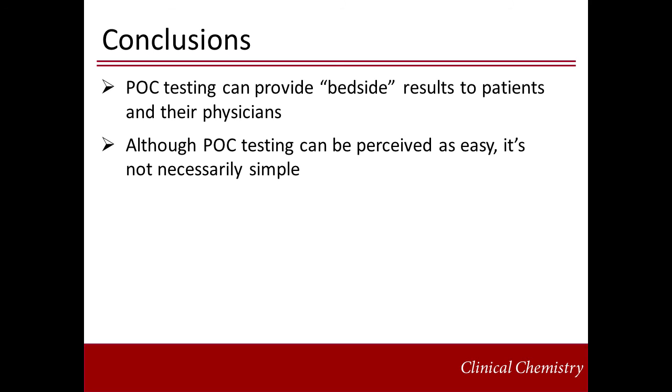In conclusion, POC testing can provide rapid results in the clinical flow. Although this is seemingly quite attractive and can be beneficial to patient care, POC testing is not as simple as it appears.